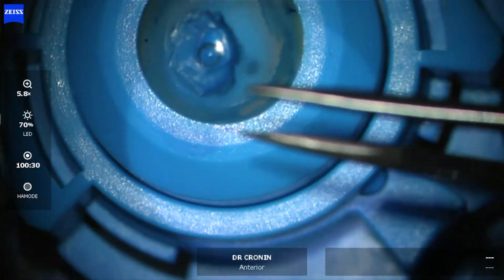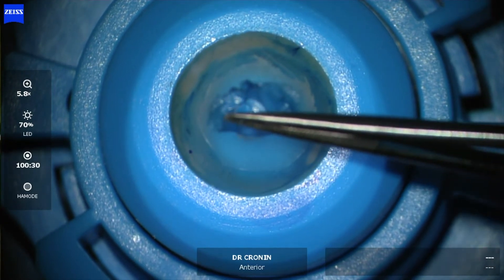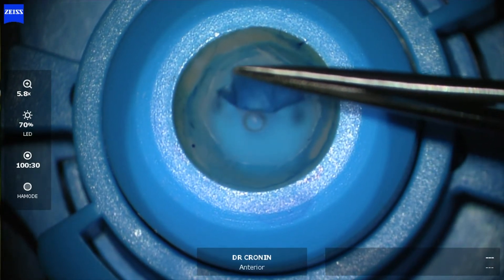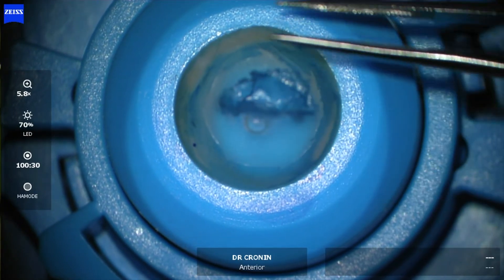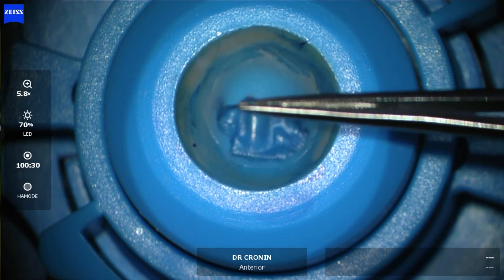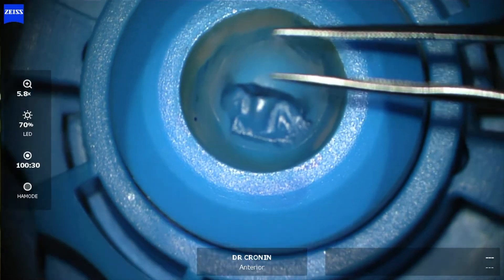What I'm demonstrating here is just how tough Bowman's membrane is. This is a donor cornea that's been mounted on a special little device to allow me to peel off Bowman's membrane, which is at the front of the eye. What I'm showing is that the Bowman's has been stained blue to visualize it — that blue disappears quickly — but Bowman's is a very tough, very strong part of the eye.